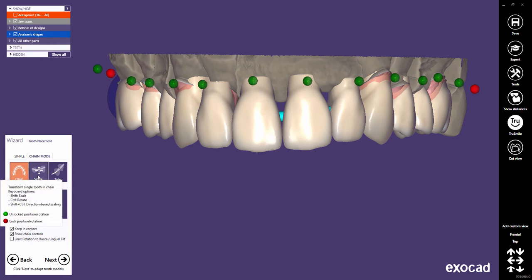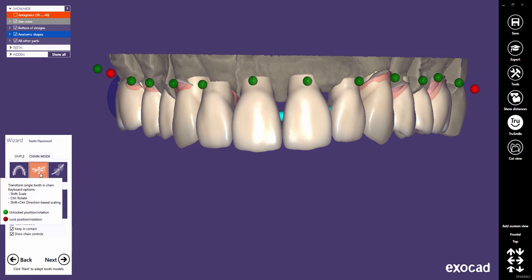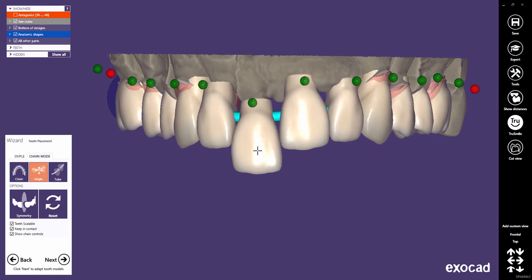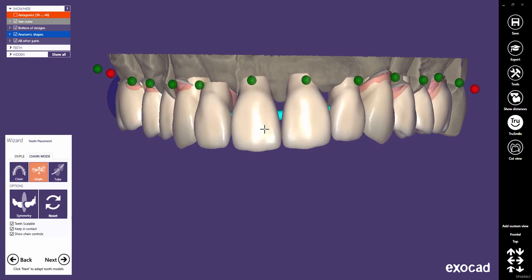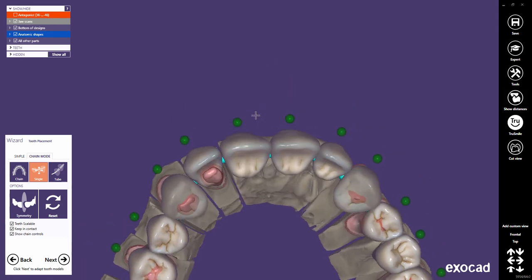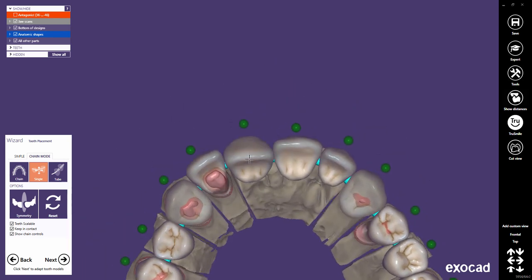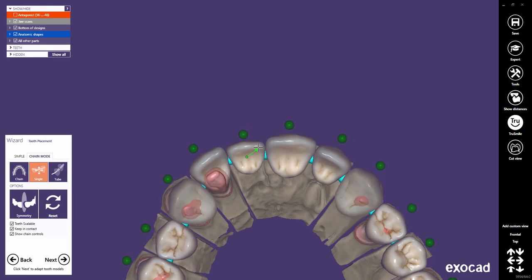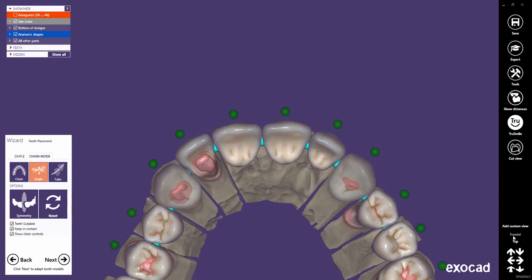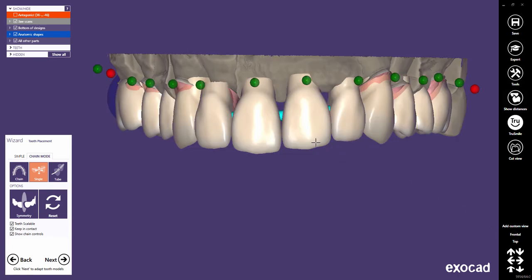Let's now switch to Single mode. In Single mode, moving or rotating a tooth does not directly influence the placement of adjacent teeth. Moving or rotating a tooth may only change the position of adjacents as they all remain in contact in the chain. As you can see, rotating tooth 11 does not rotate the adjacents. Scaling has the same effect as in chain mode. The Single mode is perfect for fine tweaking on individual teeth.